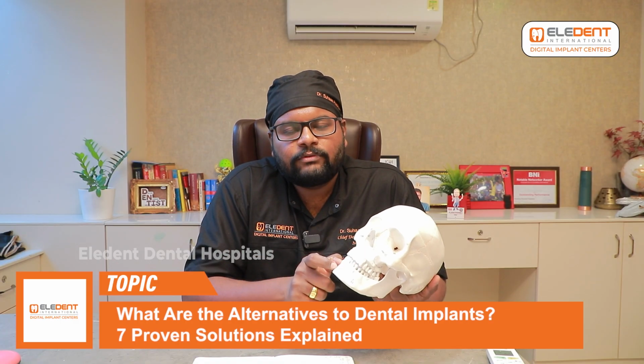First one is bone augmentation. So we add bone particles, or we take a bone from some other part and place it here and wait for 3 to 6 months and then place an implant.